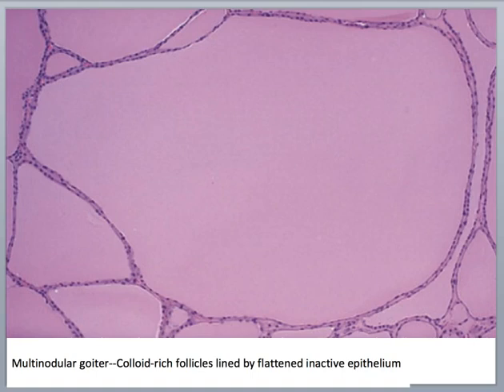So I hope that helped illustrate some of the morphology from the study guide and the reading material, and reinforce some of these ideas about distinguishing these significant entities. Thanks.